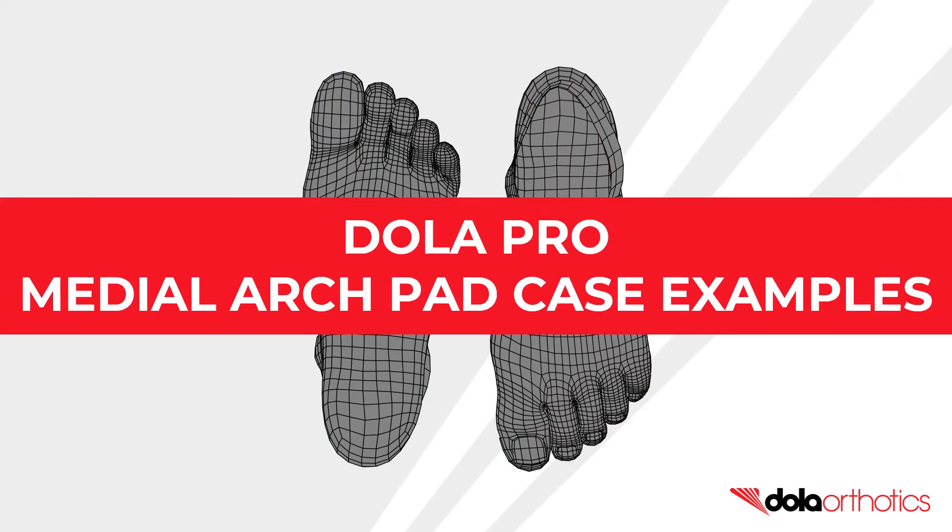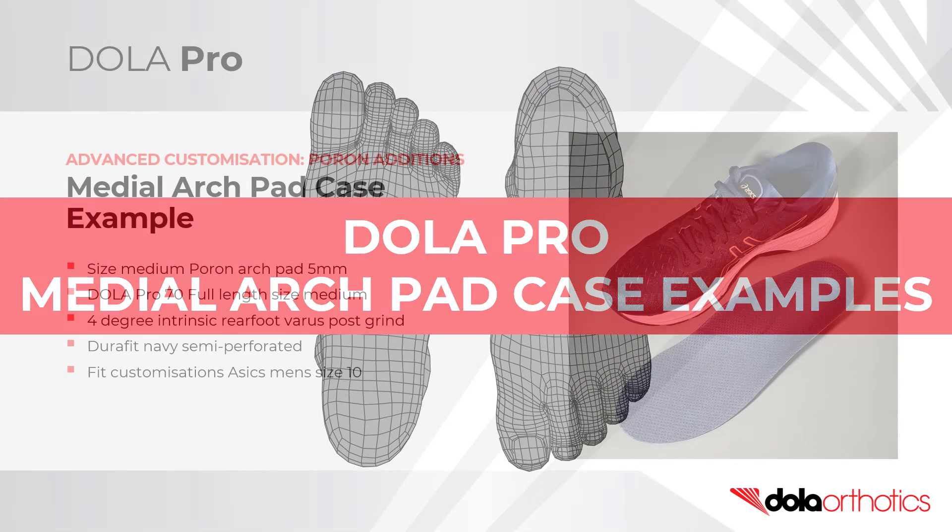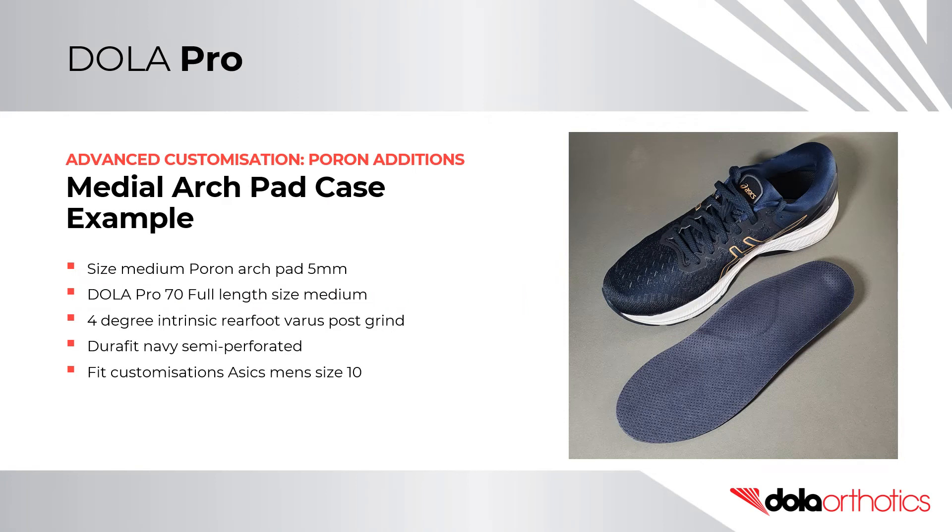In the first case example, a size medium Poron arch pad was placed on a size medium 70 soft density full length orthotic shell. The prescription was completed with a 4-degree varus intrinsic rear foot post grind, semi-perforated navy Durafit top cover, and fit customizations for an ASICS size 10 men's sport shoe. The full length orthotic is designed to be customized to various footwear types in clinic.